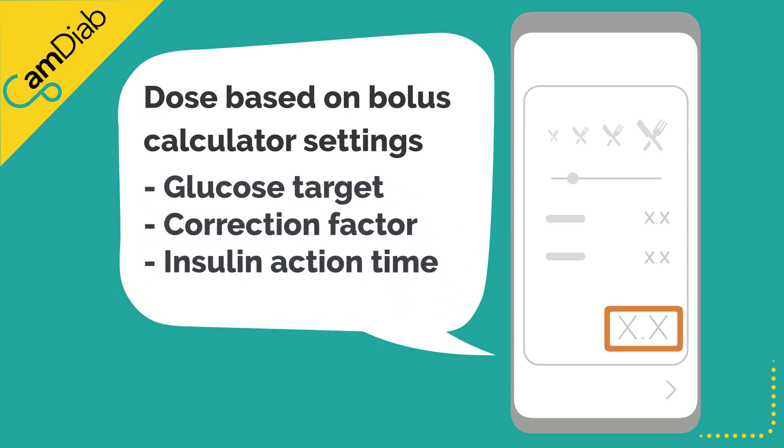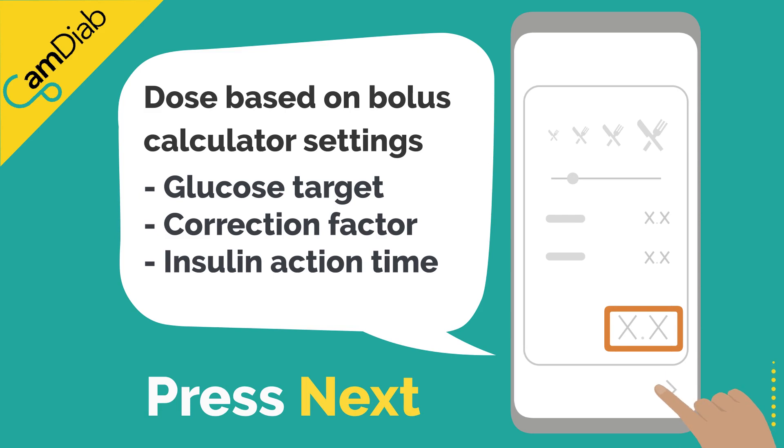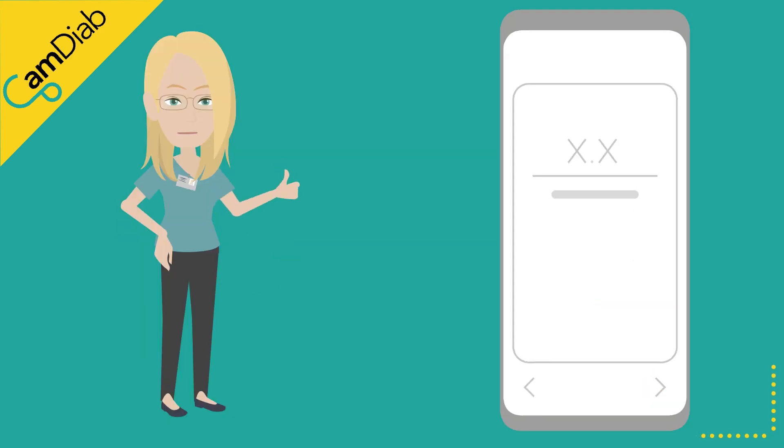These settings include the glucose target, correction factor, and insulin action time. Press next. If you're happy with the insulin dose, press deliver.